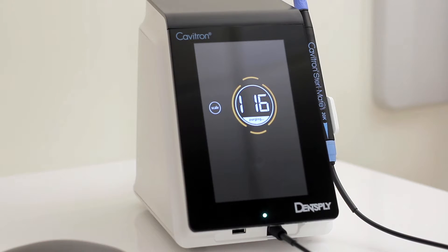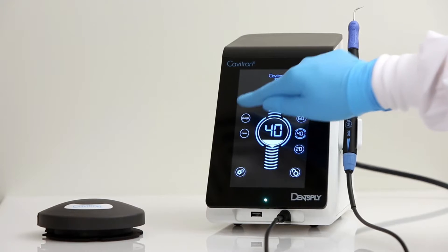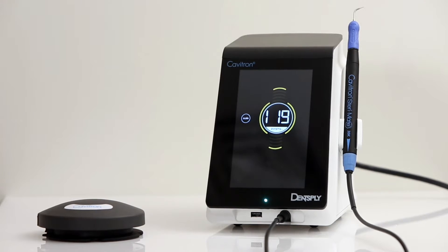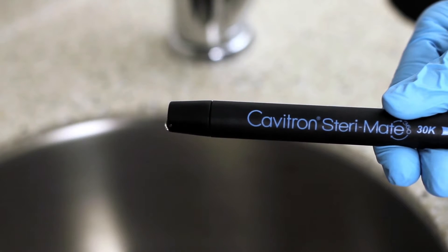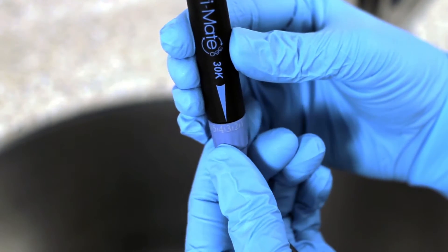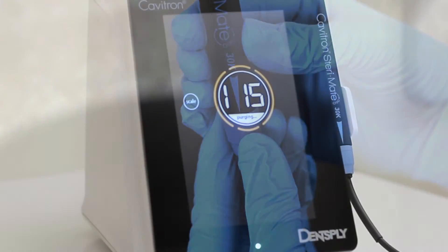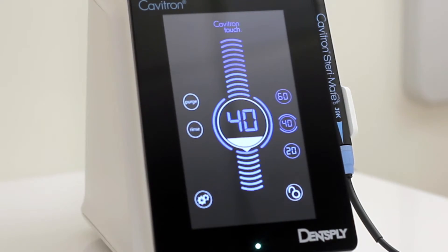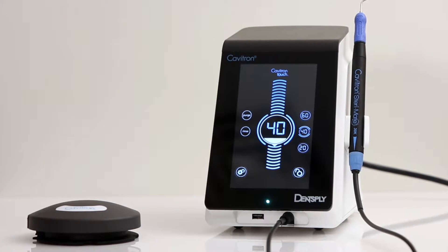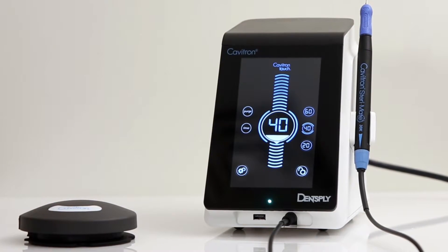Use of Purge Feature: This setting is used to flush the water lines at the beginning of the day or between patients. Purge will run automatically for 2 minutes and adjustments can be made for maximum water flow, with a countdown in seconds shown on the screen. Push the scale button to return to the main screen or simply tap the foot pedal. After a 2-minute countdown, it will then return to the main screen.